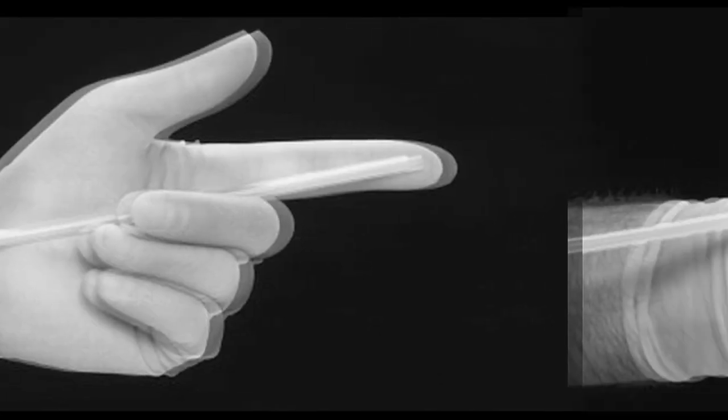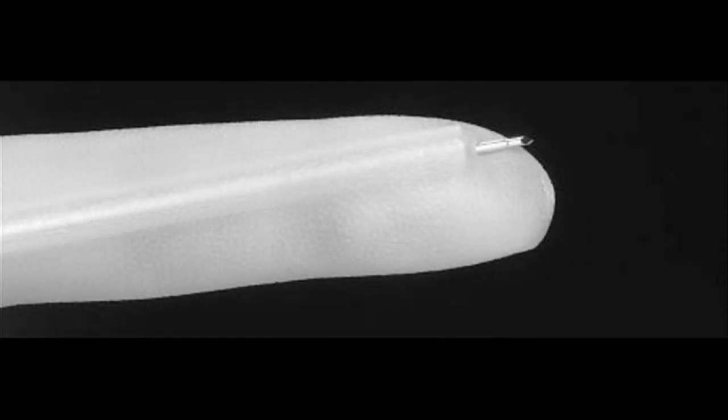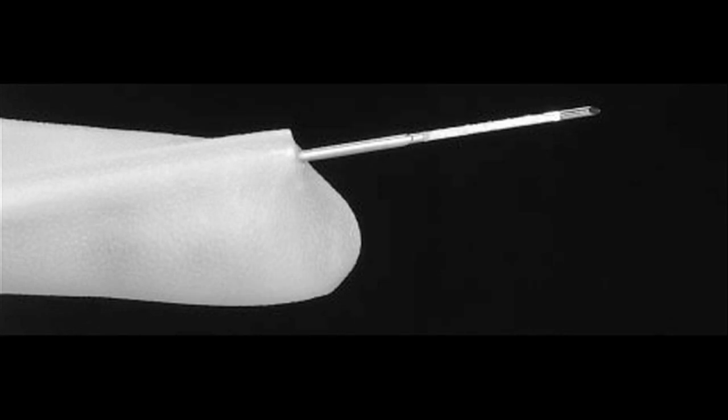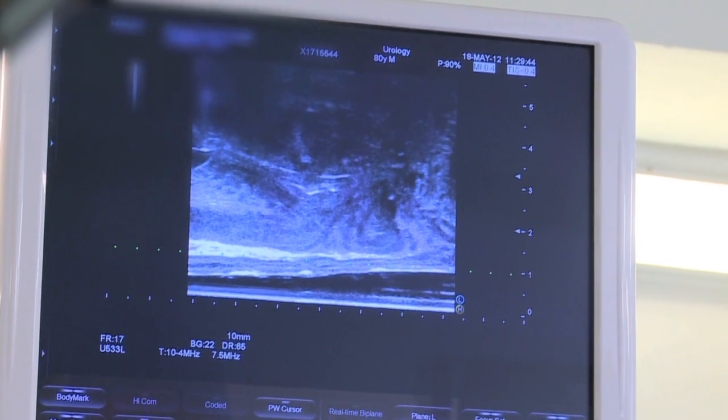When I was starting out in medicine and in urology, the first job that I ever had was putting a finger into the back passage and firing a needle, something called a Franzen biopsy needle, into a patient's prostate gland. The finger would identify the disease and the finger would guide the needle, and the needle would go through the perineum in very close proximity to the finger. Towards the end of the 80s, transrectal ultrasound became available, and with that came the opportunity to do transrectal ultrasound-guided prostate biopsies. That has been the mainstay of prostate cancer diagnosis for the better part of 20 years.